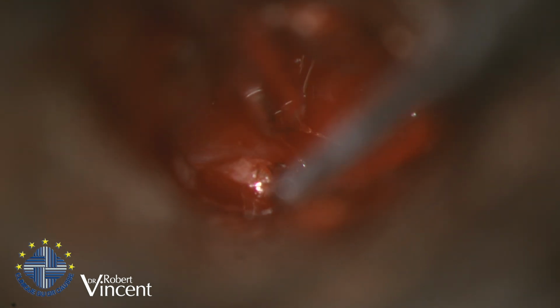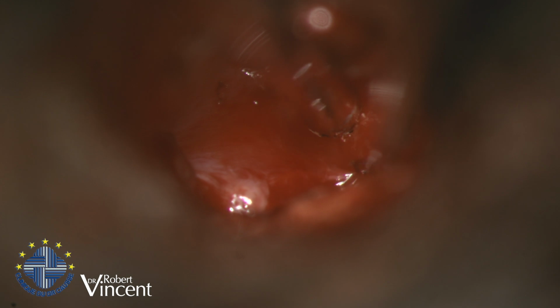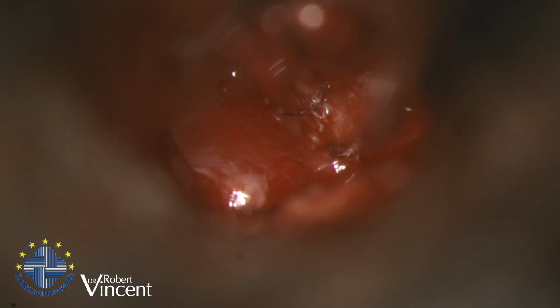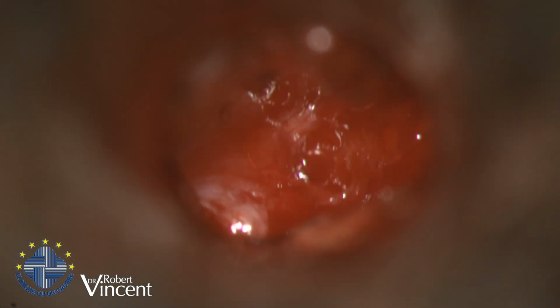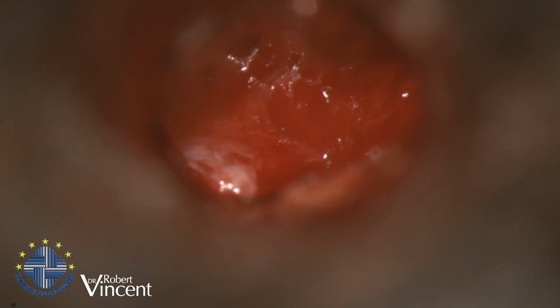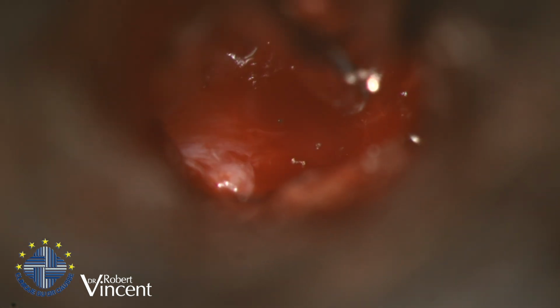There's no question of landmark. We have the promontory on the right, and you can see the facial nerve here. This is the adhesive band that I cut. Un 9, s'il vous plaît. I like to use a micro hook for this kind of thing.